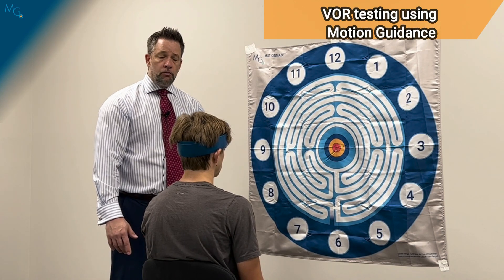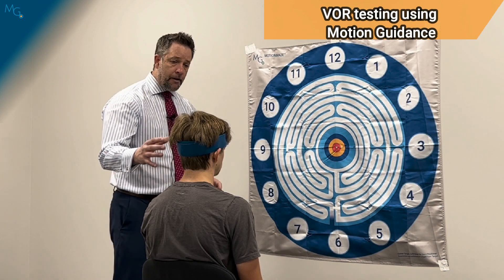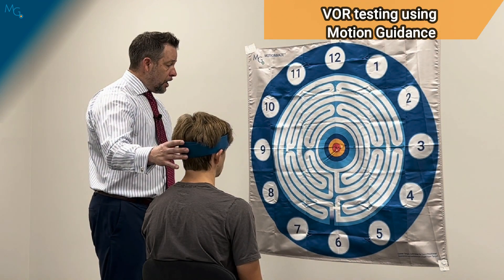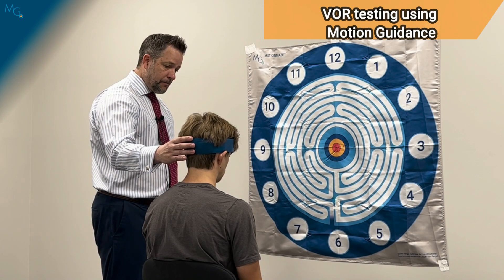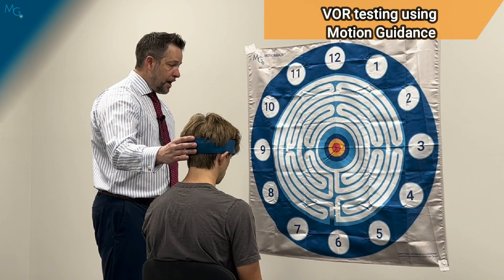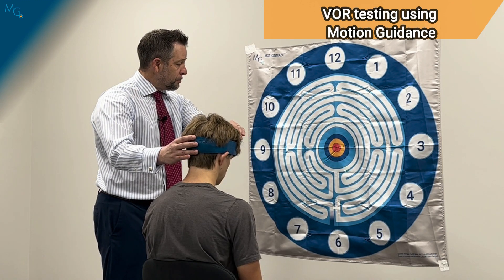Most of you will be familiar with the slight downward gaze with the VOR, so I'm going to have the patient tilt their head down to look at the six. We're going to be performing the VOR in that plane, and then I'll bring the laser back up.